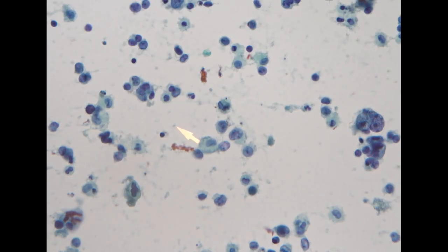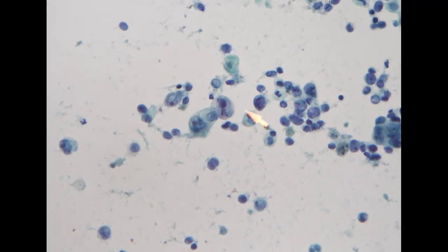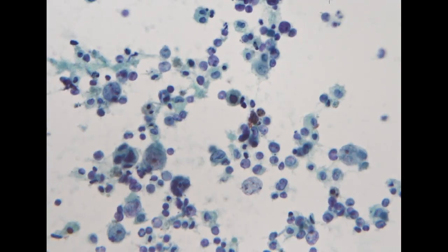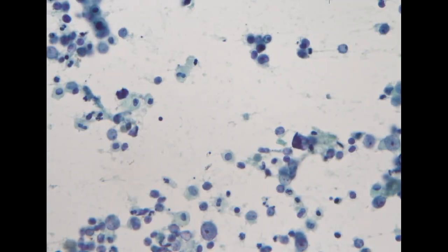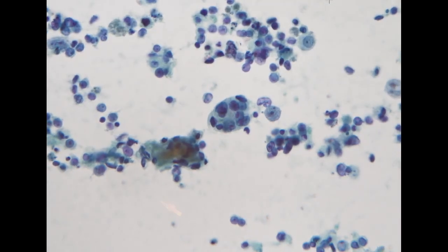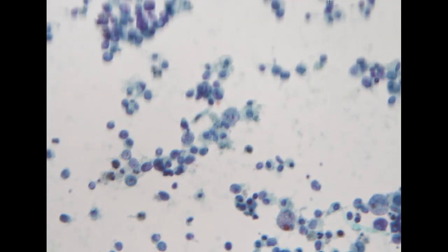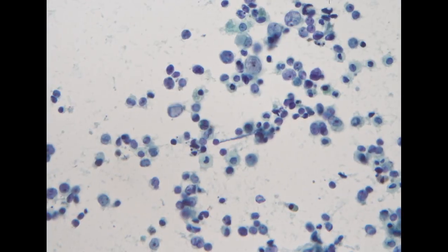So it looks like there are some atypical cells, likely carcinoma. I think for this one, this is more obvious because it's forming a tighter cluster. But the majority of them show very discohesive individual cell patterns. Some of the cells even look a little bit like atypical lymphoid cells. But if you pay attention, you can still see some very rare clusters. So it is likely a poorly differentiated adenocarcinoma. And the morphology is a little bit unusual.